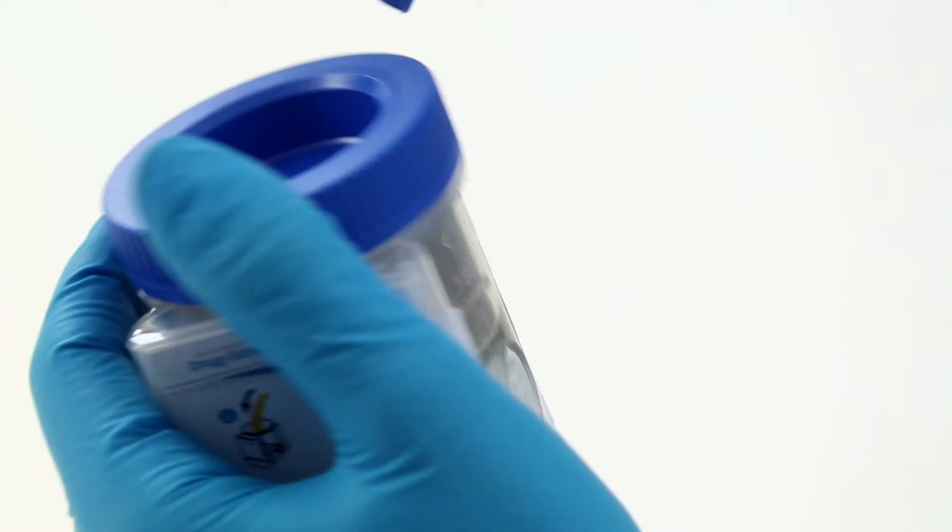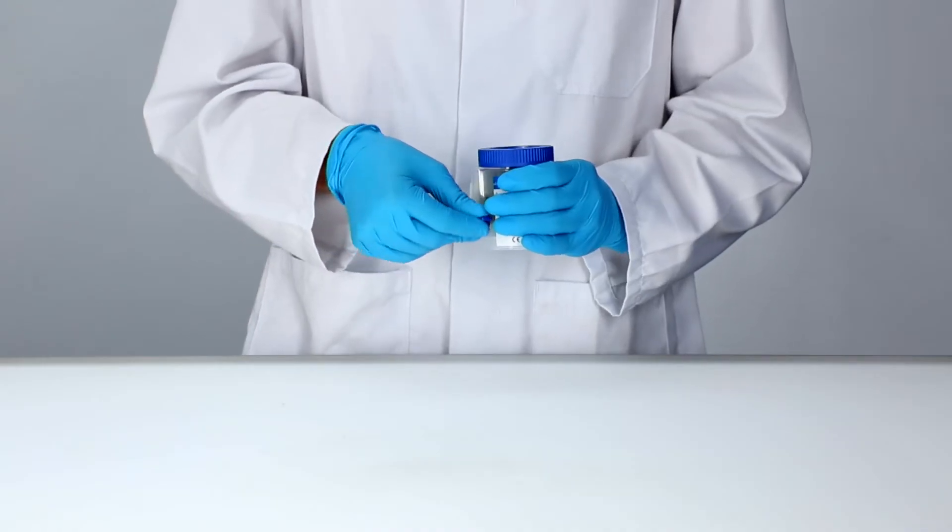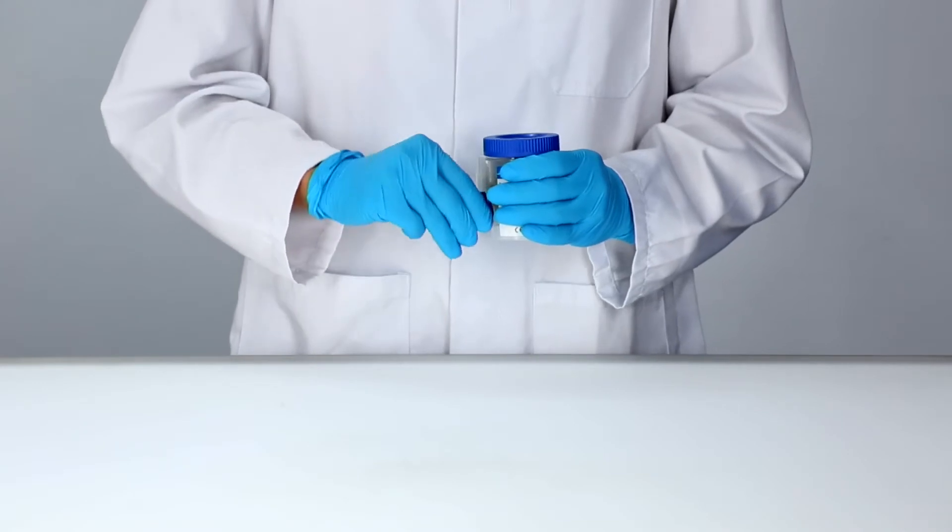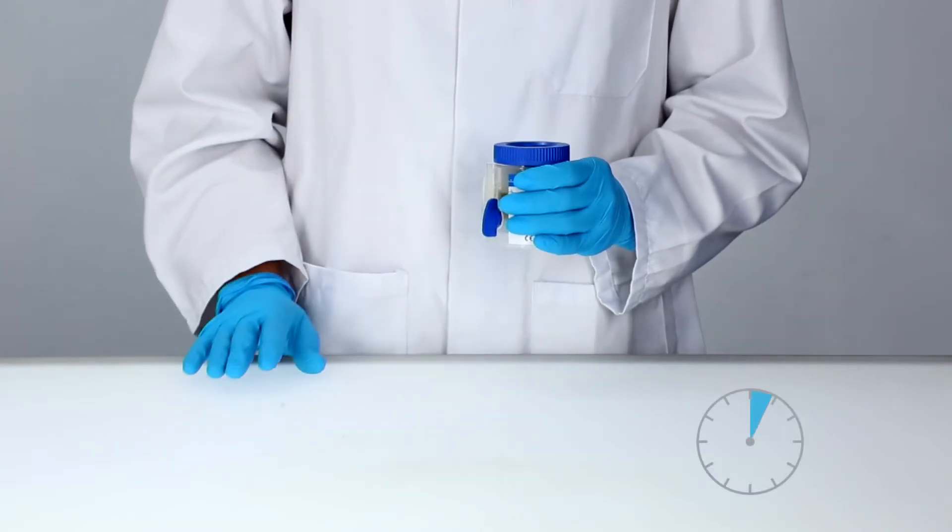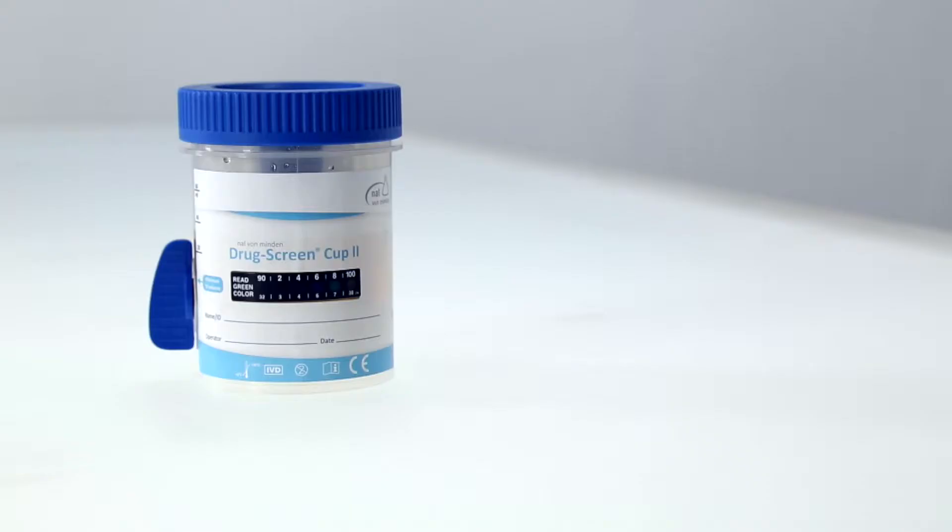Remove the key from the lid, put it in the keyhole provided and turn it 180 degrees clockwise. Start your timer immediately. Remove the peel-off label and place the test on a flat surface.